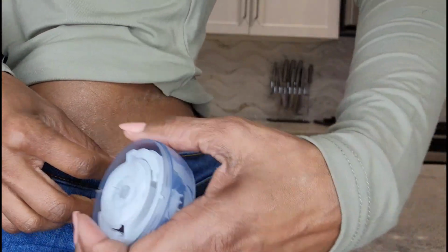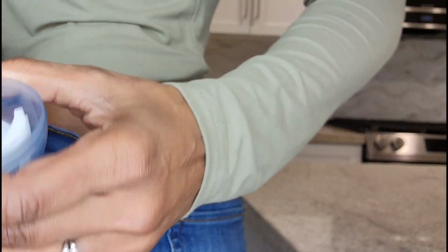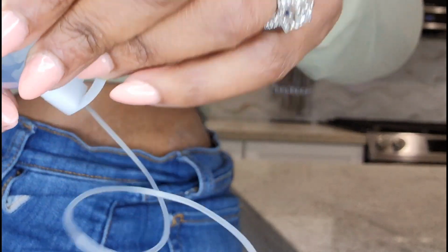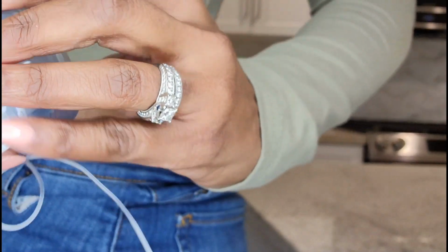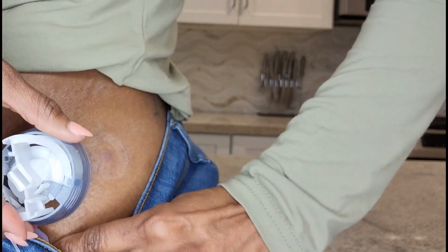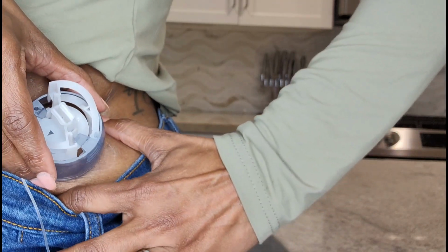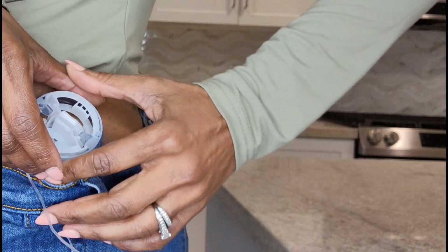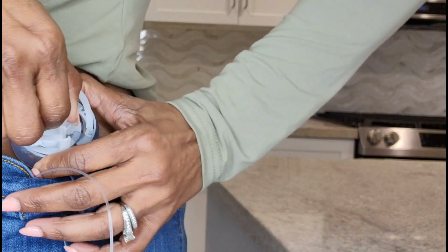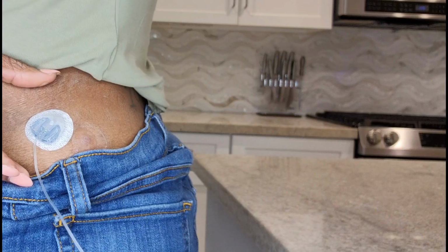So with that being said, I'm gonna go ahead and insert this. So we just take this little tool. Y'all see that needle is still there, but it's not gonna actually stay in me, it's just used to insert it. So I'm gonna find a different spot. So I'll probably just come a little higher, and then you squeeze like that. Ooh, little sting, just a little bit. And we're gonna pull that and voila. Let's go. And that right there is how to properly change an insulin pump.